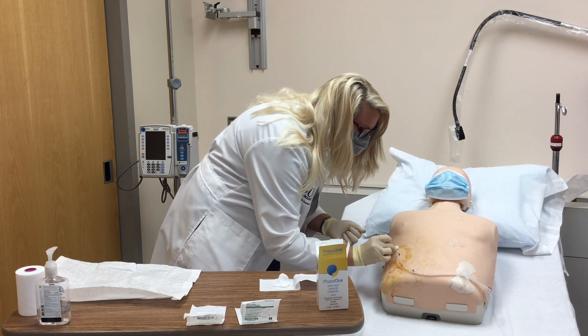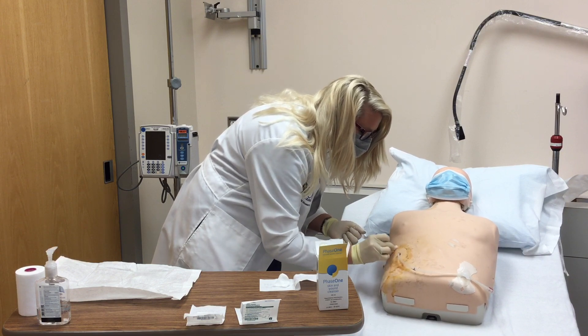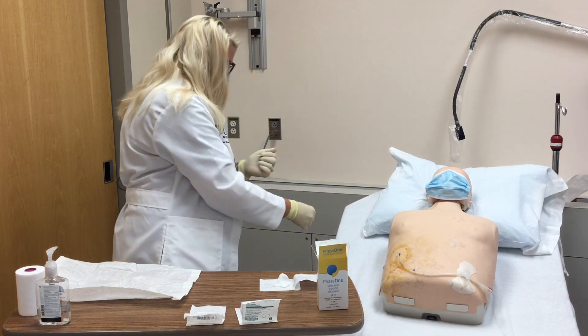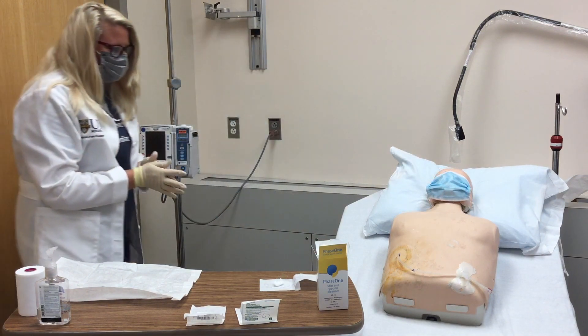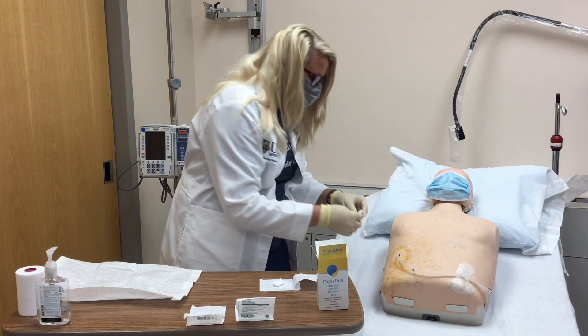If irritation is occurring at this point, you can rinse the area with sterile saline. Once the site is dry, tuck the split gauze under the driveline at the exit site.